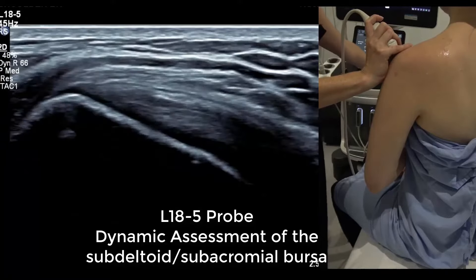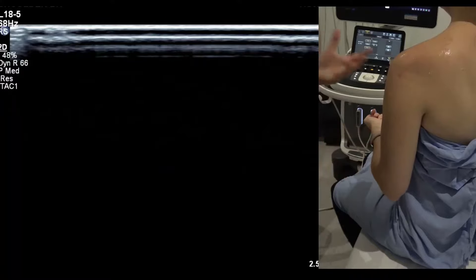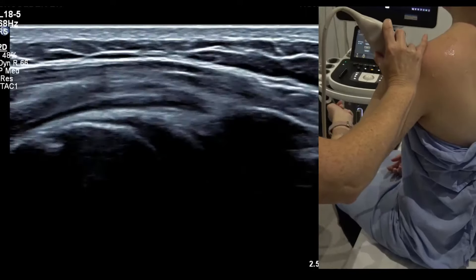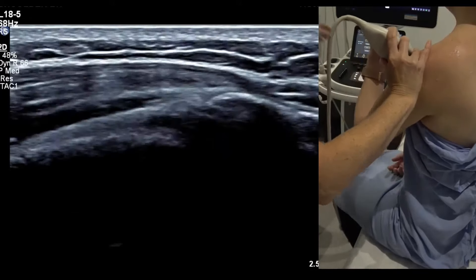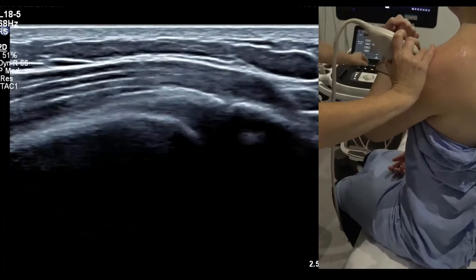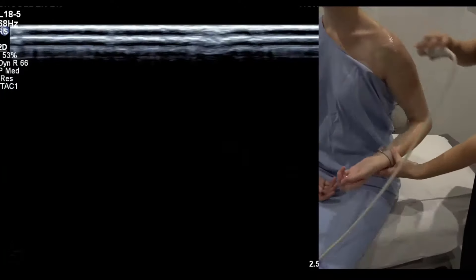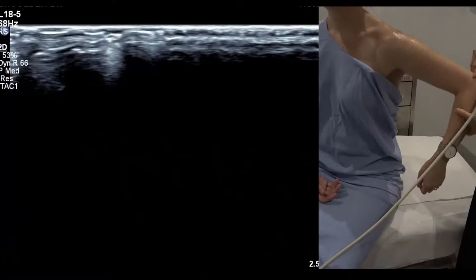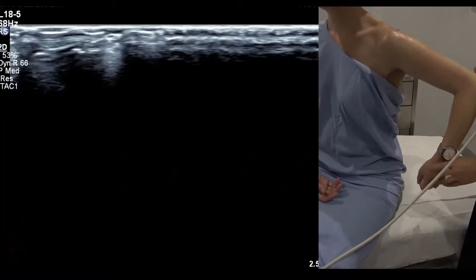The last thing we're going to do is look at the bursa dynamically. In mild bursitises you might not see too much bursal distortion just with abduction. You can have them punch up under someone's chin in forward elevation, sitting just anterior to the acromion. But the most effective position for seeing bursal distortion is what I call scarecrow to stop sign — similar to our sleeve to singlet view. Ask the patient to bring the elbow roughly level with their shoulder, with the forearm pointing down.